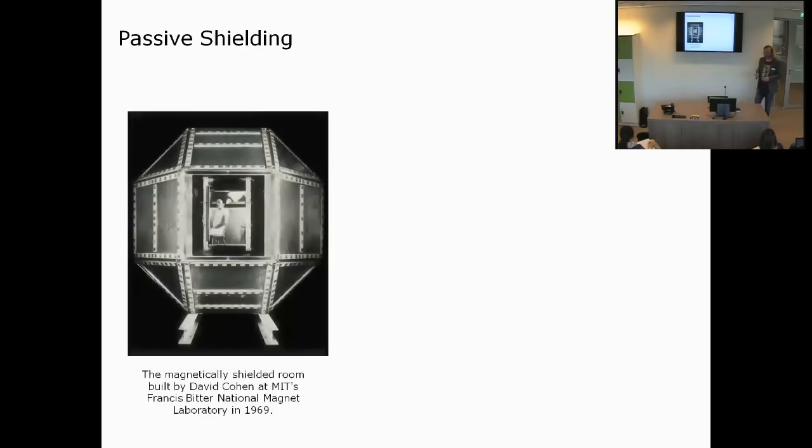Let me first explain the shielding. So we have these SQUIDs. They're sensitive, SQUIDs coupled to magnetometers. These are very sensitive to the magnetic fields from the brain, but also to environmental noise. So that means that we have to put them in an environmentally shielded room.